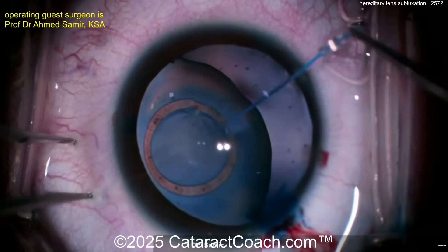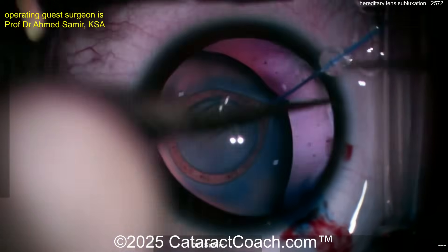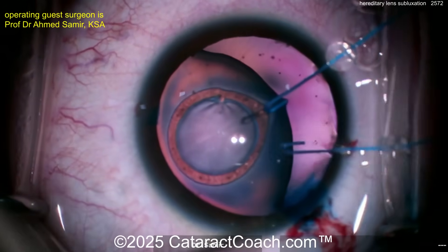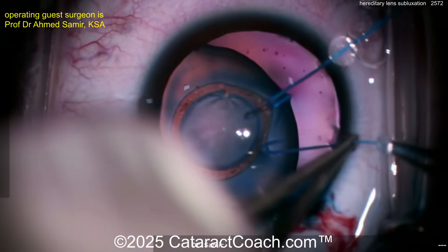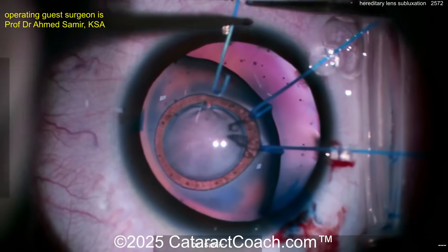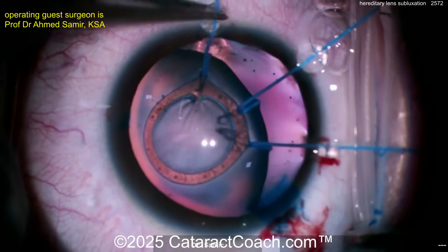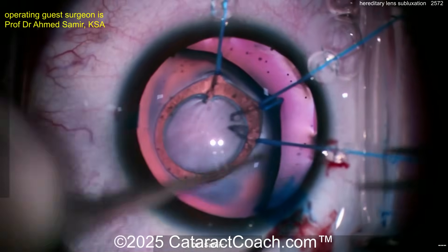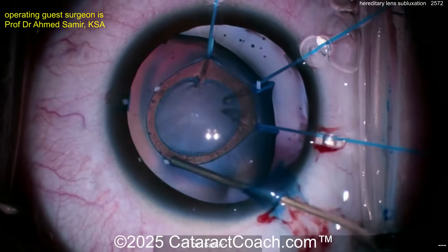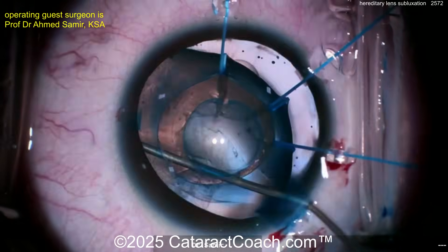Now putting in iris hooks — I'd love to have lens hooks instead, but iris hooks can grab that lens. Don't poke through the capsule though. The tip of the iris hooks is kind of sharp going up against the lens capsular bag equator — be very gentle here trying to re-center this lens. The question is: are you going to save the bag or remove it completely? A little bit of hydrodissection — the lens nucleus is soft; this is a young pediatric patient.